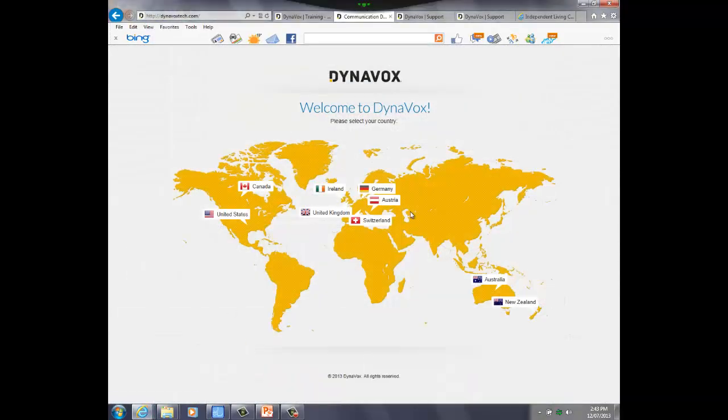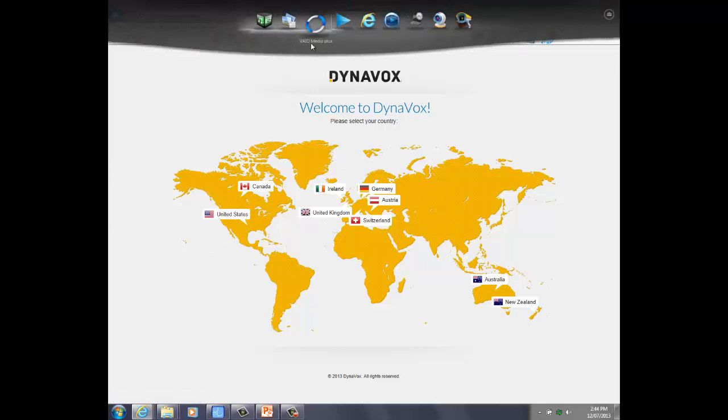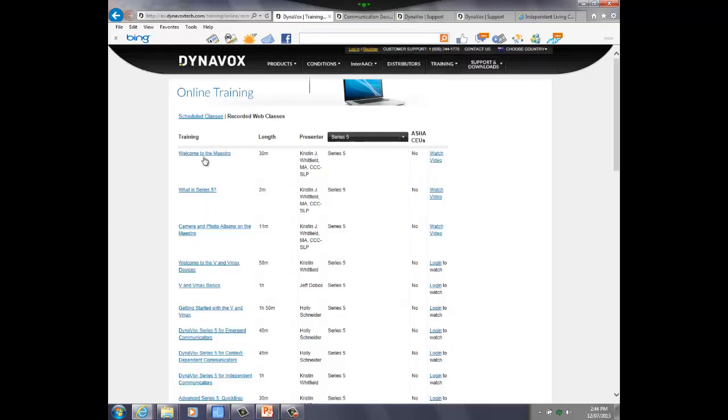So when you head on to the Dynavox website, you can just choose Australia or America. The information is much of a muchness. Here under Dynavox training, I was able to go into what we call the recorded web classes as opposed to the scheduled ones, which are run at US times that often aren't convenient. From here I can choose the particular device that I'm working on. So the Series 5 software covers both the Dynavox V and VMAX as well as the Maestro. So here you could log in and be able to watch a number of different videos about your specific device.